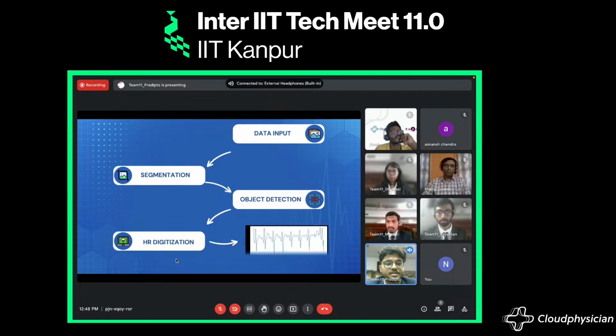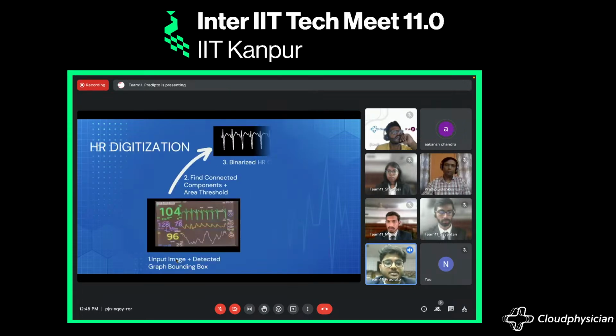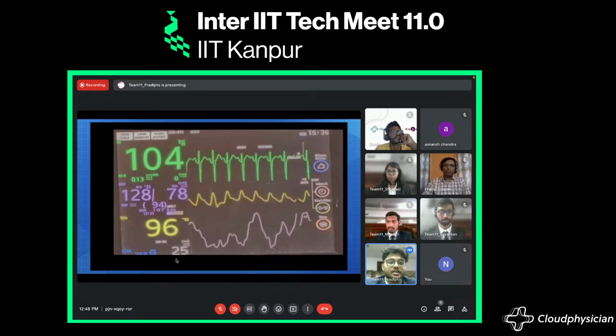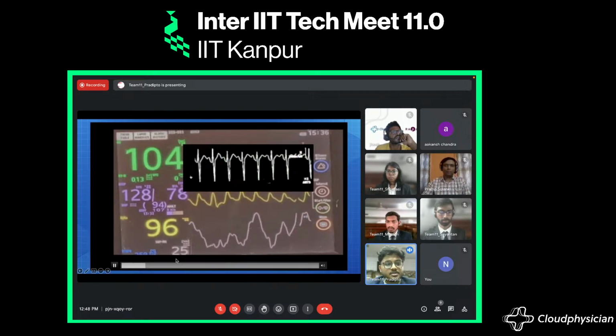Finally, we shall address the problem of digitizing the HR graph. After object detection, when we get the bounding boxes of HR graph, we crop the image and we apply image processing like connected components area threshold. And from the binary image, we detect the height of the white pixels and get the matplotlib plot. Here we see the animation of the HR digitization process.